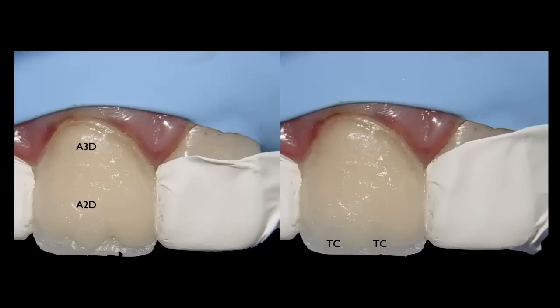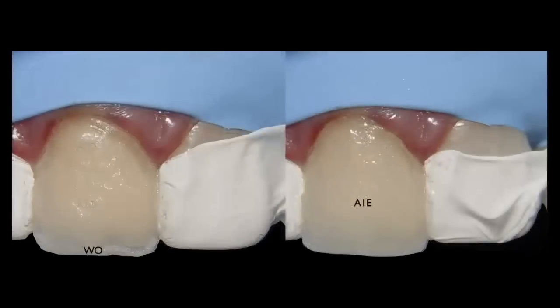And then I'm going to light cure that A2D, that A2 dentin, right on the middle third towards the incisal third of this tooth. Once I complete light curing this layer, I'm going to go ahead and add the translucent clear, which is a gray translucent that I need in order to mimic that grayish area that we all saw through the mamelons of this natural tooth. So with that translucent clear that I have placed between the mamelons, my expectation is that when I place my final enamel layer, this area is going to be more translucent because we have less dentin, which is more opaque, and more gray or clear translucent, which obviously is going to create that translucent effect in that area.